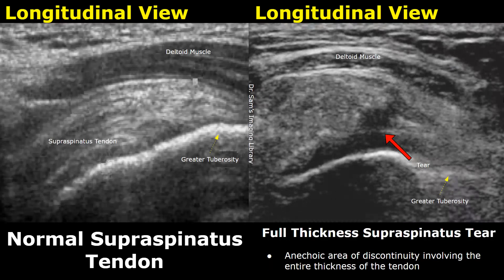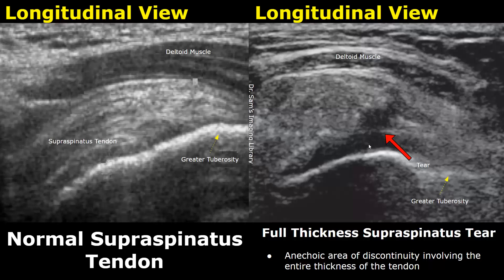This is a case of full thickness supraspinatus tear. In a full thickness tear, we will find an anechoic area of discontinuity that involves the entire thickness of the tendon. When we see this anechoic area involving the full thickness of the tendon, we can call it a full thickness tear.